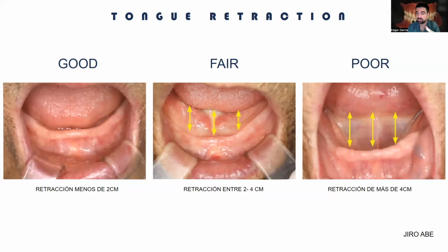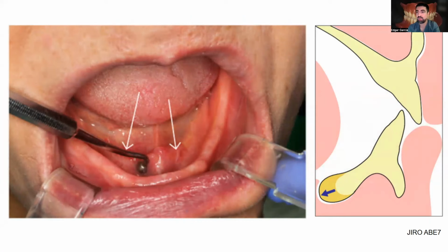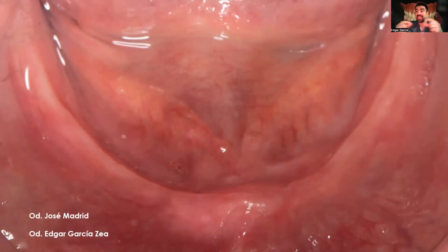When we have this kind of patient, we have to thicken the area because we want to seal that part. We want to prevent the patient from breaking the sealing. This part we obtain, we thicken it when we are doing the border molding. We put a lot of impression material in this area to thicken it.